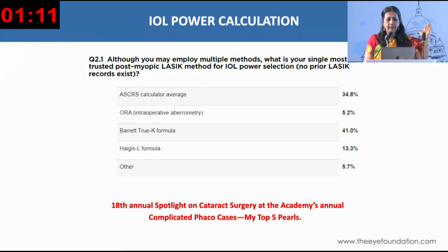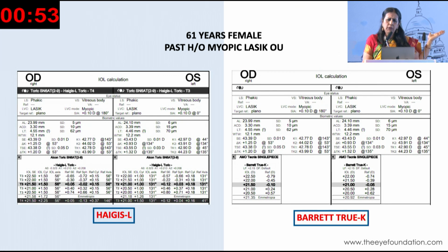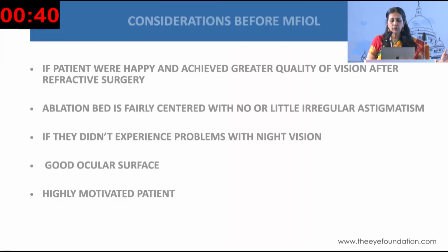For that, again, there was this spotlight on asking audience questions, and it was found that many people felt that the ASCRS calculator, the Barrett True-K, was the best, followed by ASCRS. And then came Haigis-L. So this is how each person had experienced. We tried this on our patient here, and if you look carefully, maybe the lettering is small, but what came true was the patient needed toric in both eyes, but he did equally well with the Haigis-L measurement and the Barrett True-K measurement.